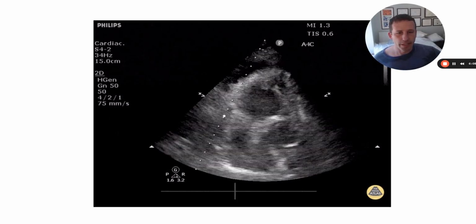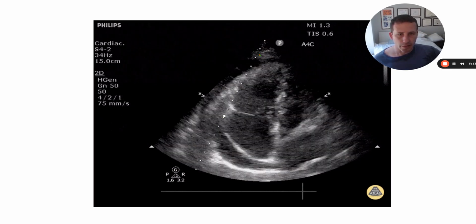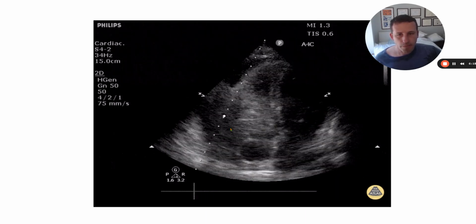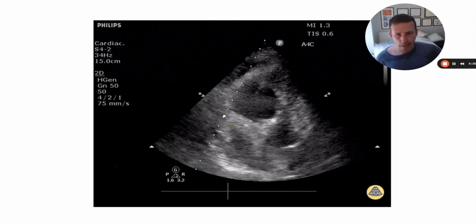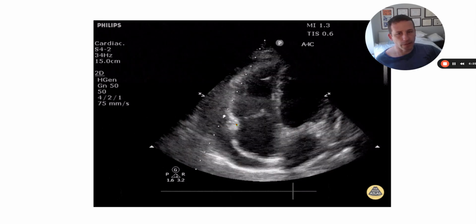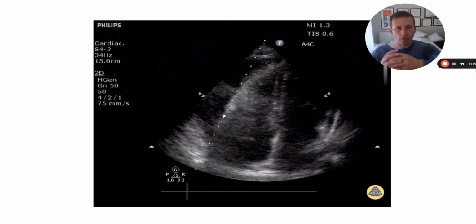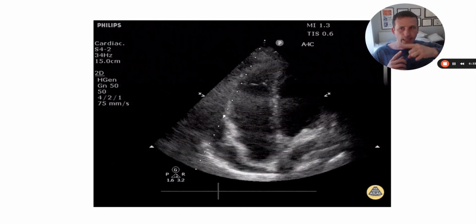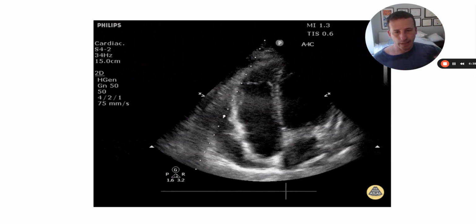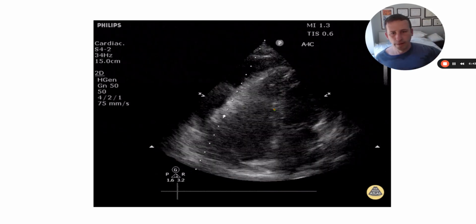All right, this heart is moving around quite a bit, but that's because there's a big effusion here. Right, so we've got a nice big effusion kind of tracking all the way around the heart. They've dropped an M mode line, and it looks like what they're trying to gather is if the RV function is reduced. You can measure how close the RV tricuspid annulus, so that housing of that tricuspid valve, how close does it get to the apex with each squeeze? That's called a TAPSE, or tricuspid annular plane systolic excursion. And when that's less than 16 or 17 millimeters, that's indicative of reduced right ventricular function.